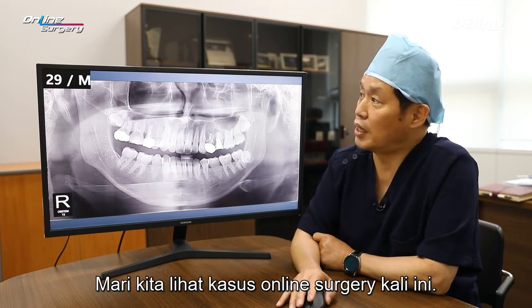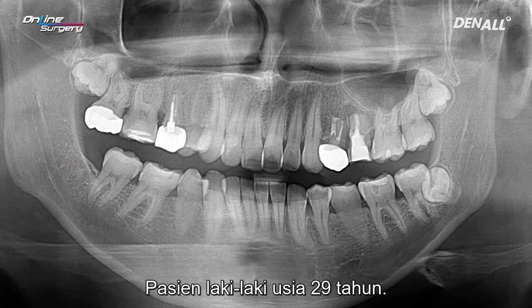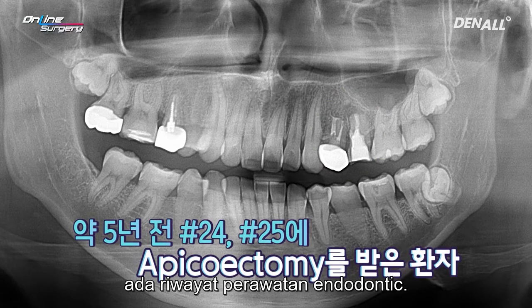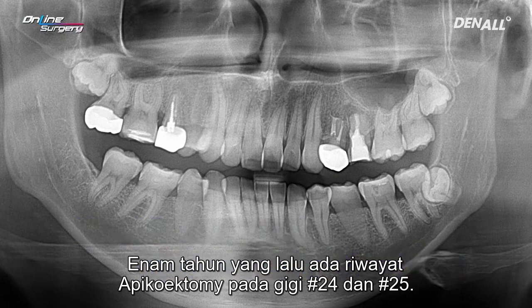Let's look at the case for today's online surgery. 29-year-old male patient. The patient does not have a special medical history. If you look at the panoramic image in 24 and 25, there's a history of endodontic treatment. 5-6 years ago, there's a history of apicoectomy in upper 24 and 25.